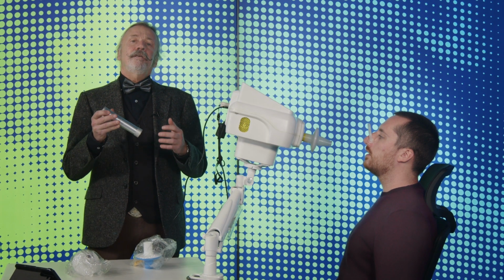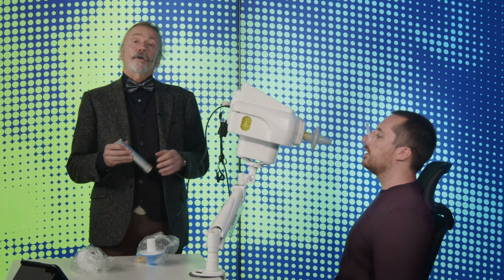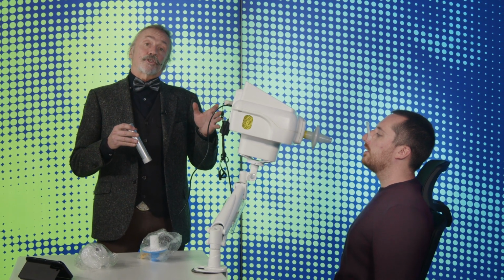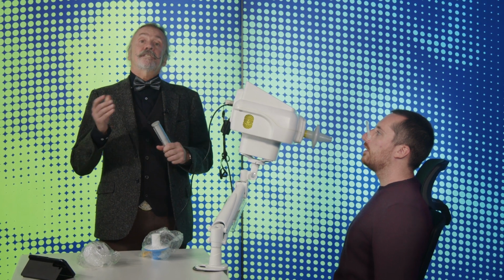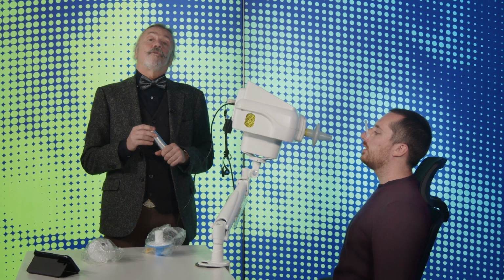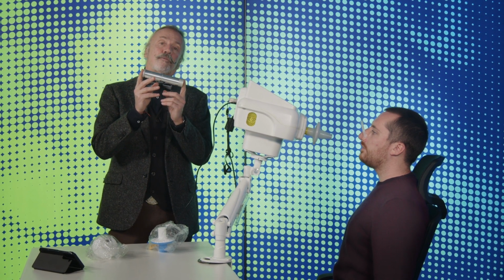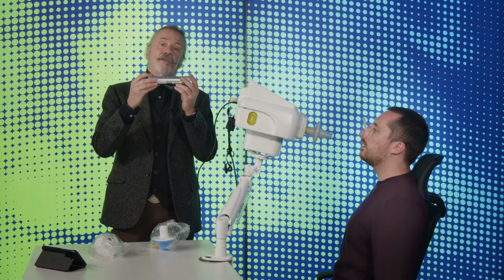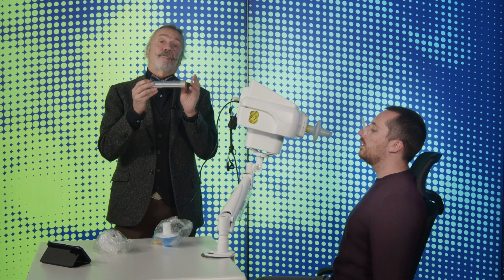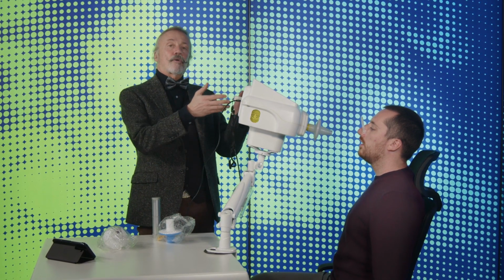To end the introduction to oscillometry or forced oscillation technique, we're going to now perform a measurement, which is the third or the fourth actually of a session. So the system will actually give us a quality control for the repeatability of the session. The system has been verified for proper calibration in the morning with the test object, which verifies it for both resistance and reactance. The device is ready to go.